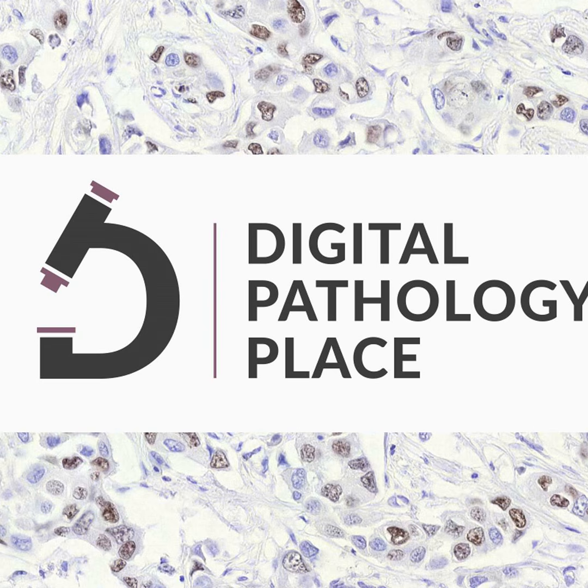Then layer 2, module 2: the mechanics, machine learning, and evaluation. In this course, at Texas A&M, they make students design an image analysis application. So what they are doing here is hands-on with YOLO. YOLO is an image analysis framework, the You Only Look Once architecture for real-time image recognition and classification. They use canine lymphoma as the entity that they're working with.